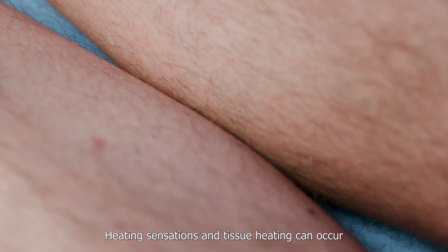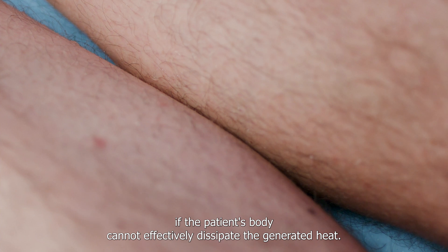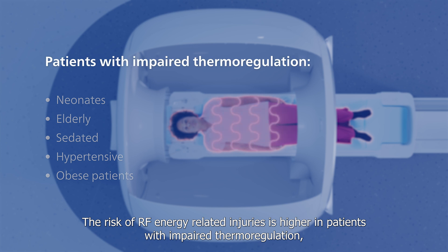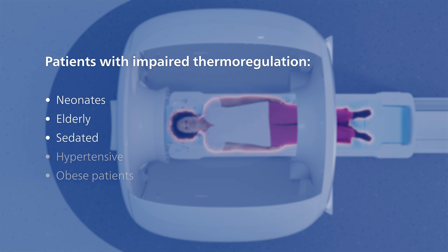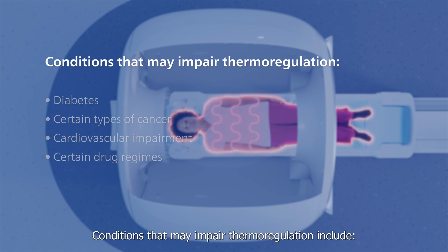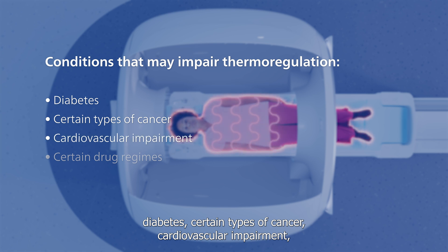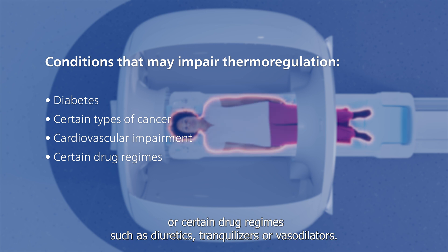Heating sensations and tissue heating can occur if the patient's body cannot effectively dissipate the generated heat. The risk of RF energy-related injuries is higher in patients with impaired thermoregulation, such as neonates, elderly, sedated, hypertensive, and obese patients. Conditions that may impair thermoregulation include diabetes, certain types of cancer, cardiovascular impairment, or certain drug regimes such as diuretics, tranquilizers, or vasodilators.